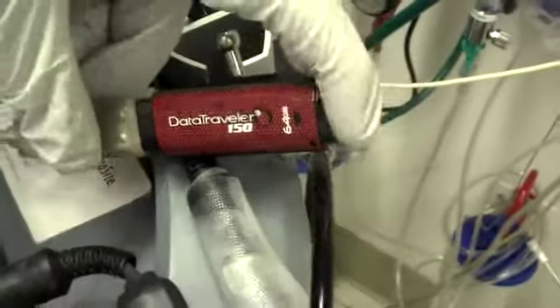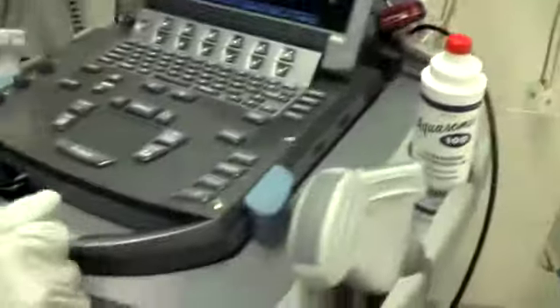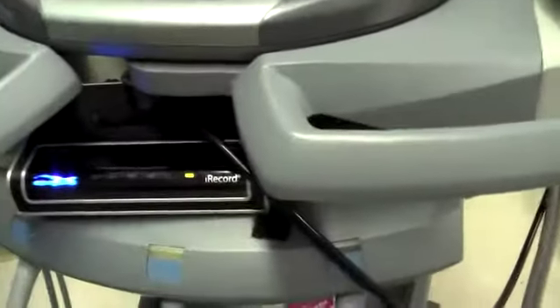If it's not all the way snug like that, or if that device fills up, which has happened a couple of times, pretty rare, but it can happen, then the light down here is no longer solid green. I just unplugged it, and you'll see now it's a steady amber. And when you try to record, it won't record. So if it's not a solid green when you're ready to go, then you're not ready to go. Great question.